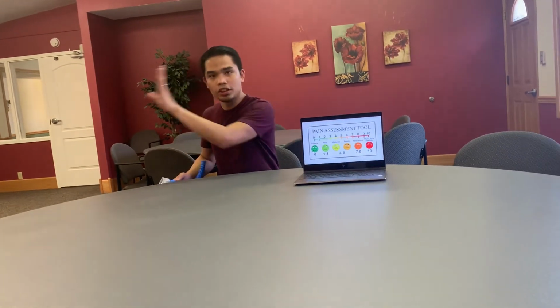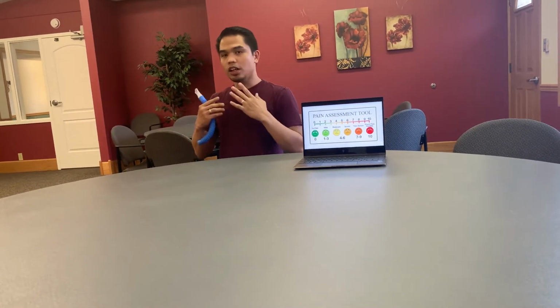Once we're done, we would always coach them through demonstration for them to fully understand the procedure. Assuming the patient is in front of me, I will let them know that they should sit, relax, with their back straightened up and chin straightened up, and they should not slouch.